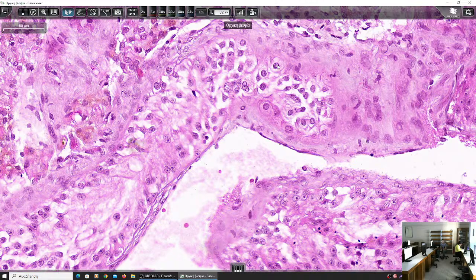So there are two forms of spermatocytic arrest. The one that we see germ cells of early stages, and the other is spermatocytic arrest of a late stage, where we can identify spermatogonia, spermatocytes, and only immature round spermatids.